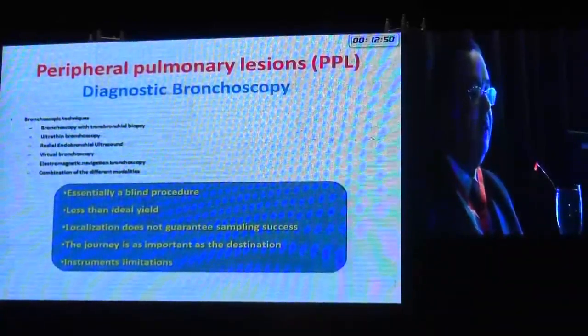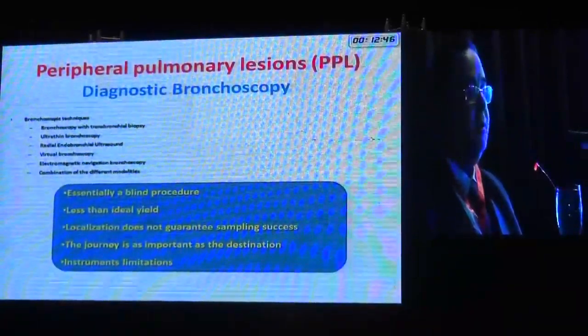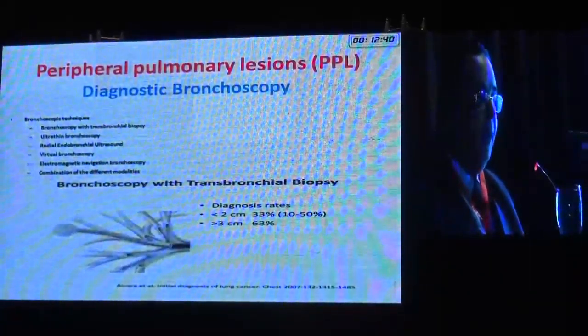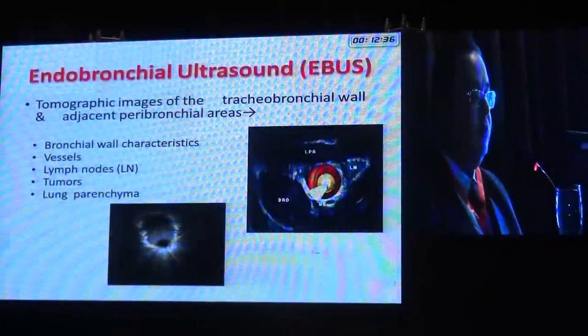The yield is less than ideal. The localization does not guarantee sampling success. The journey is as important as the destination, and there are some instrument limitations. Professor Becker has covered the transbronchial biopsy with fluoroscopic guidance, so I'm going to focus on EBUS.